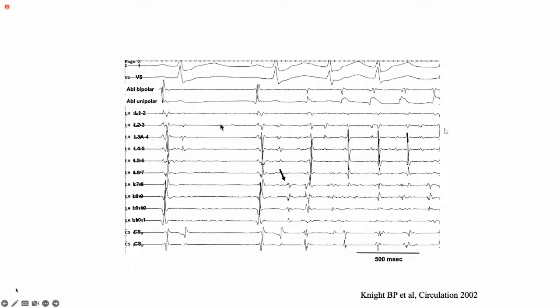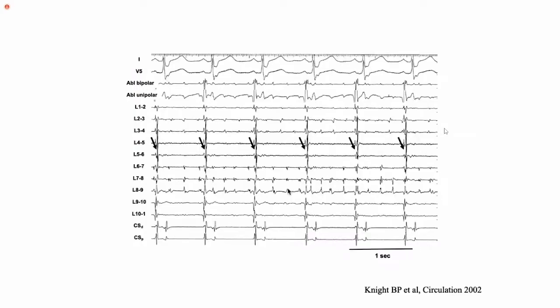And when you do that, you start realizing that these premature atrial beats that you see on the surface start much earlier than you see the P wave, and usually from a pulmonary vein. And you can electrically isolate that vein. Initially, it was a very ostial ablation. We now do a more antral ablation. And occasionally, you can still get this, even with cryo. You'll see pulmonary vein fibrillation. The vein's fibrillating, and there's exit block, and the patient's in sinus rhythm.